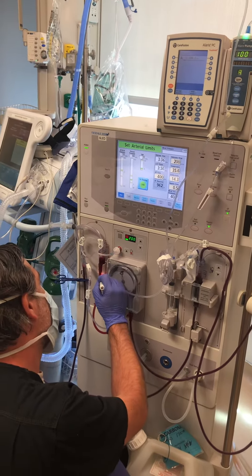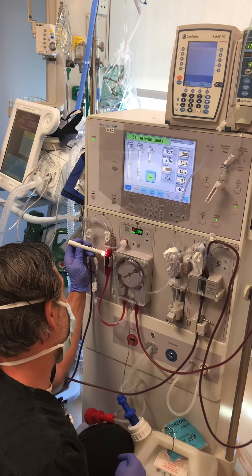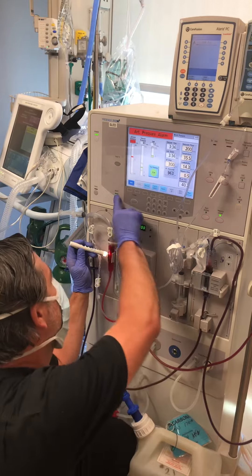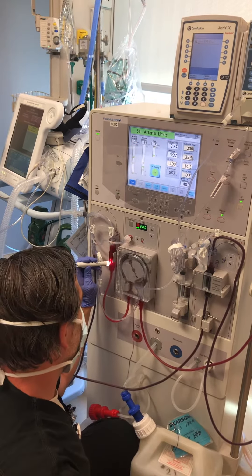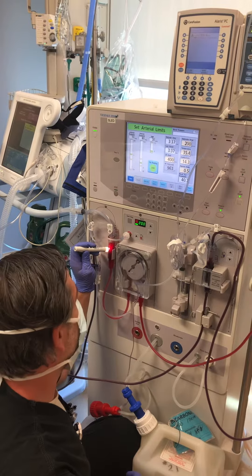What are you looking for, Jeremiah? Just looking for clots. I'm using the brightest flashlight I can find to make sure that I don't see any chunks or fibrin. It looks pretty clear right now.